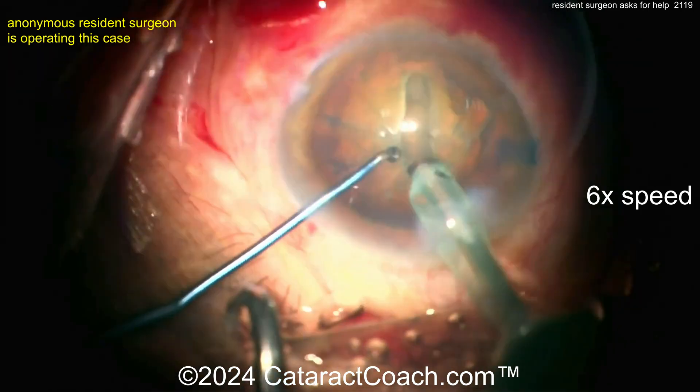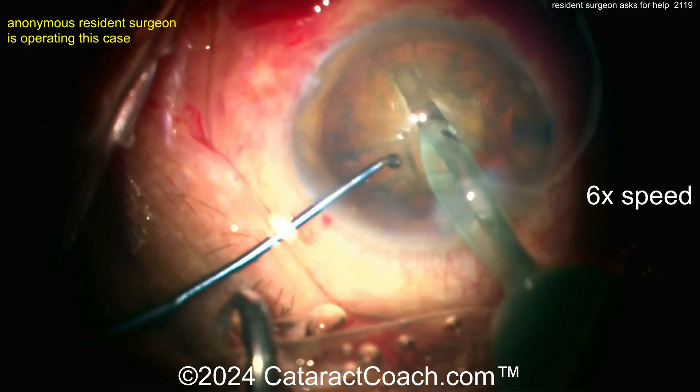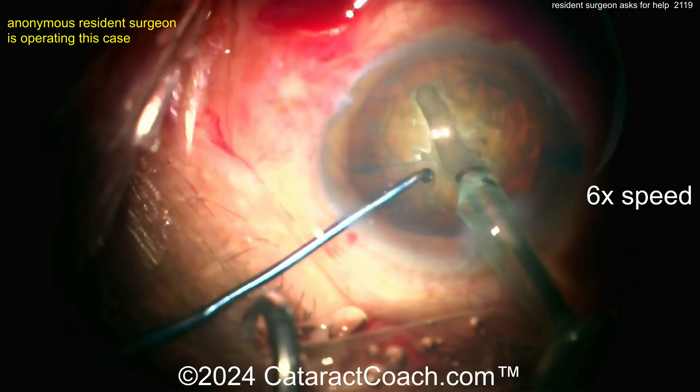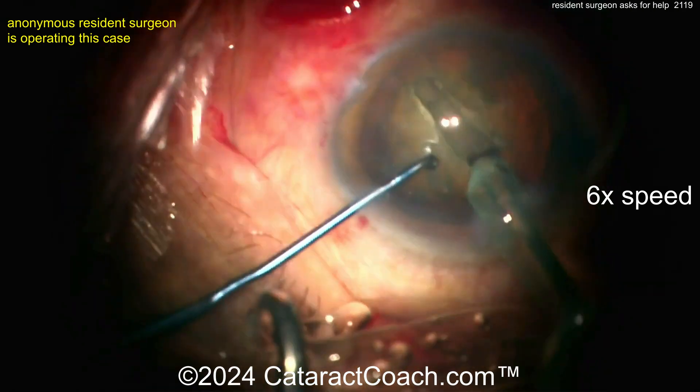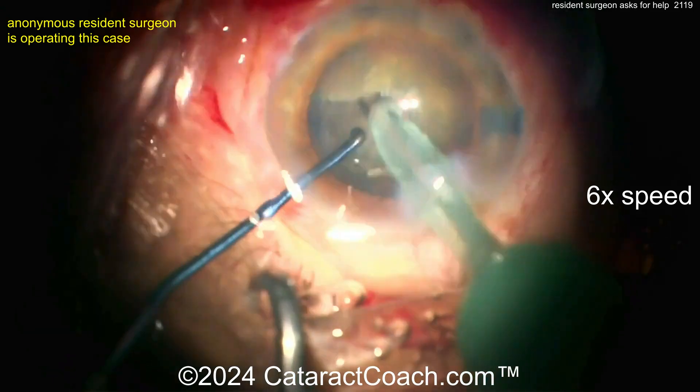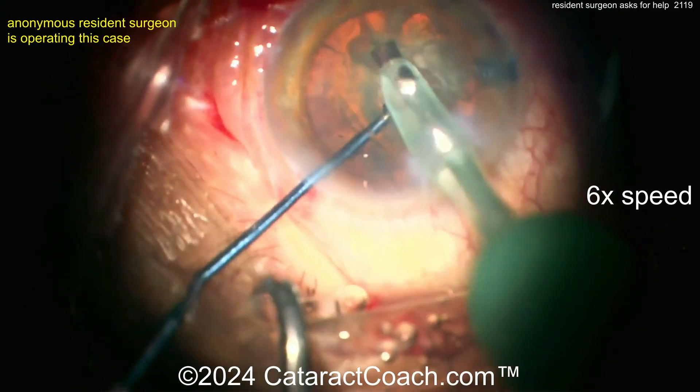Let's see a groove maybe down the middle. The groove looks okay. Try to keep the eye in primary — try not to have the eye dance around so much. Getting a groove made — that looks reasonable. Again, see how it's not centered? Where is the center of your microscope? Why are we operating way out in the periphery, halfway in the darkness? That doesn't make a whole lot of sense.